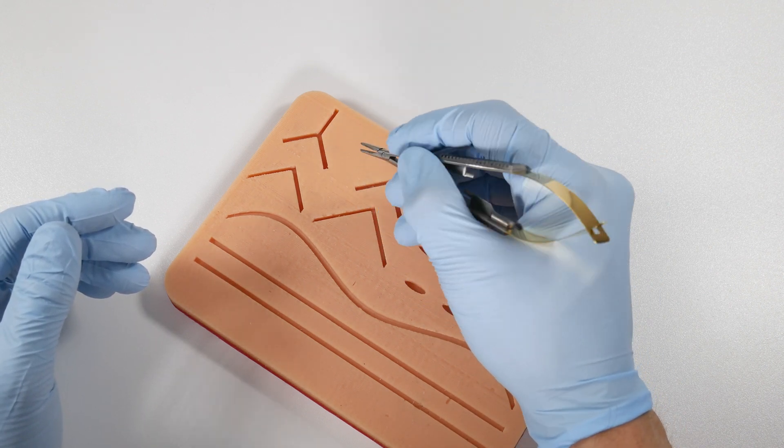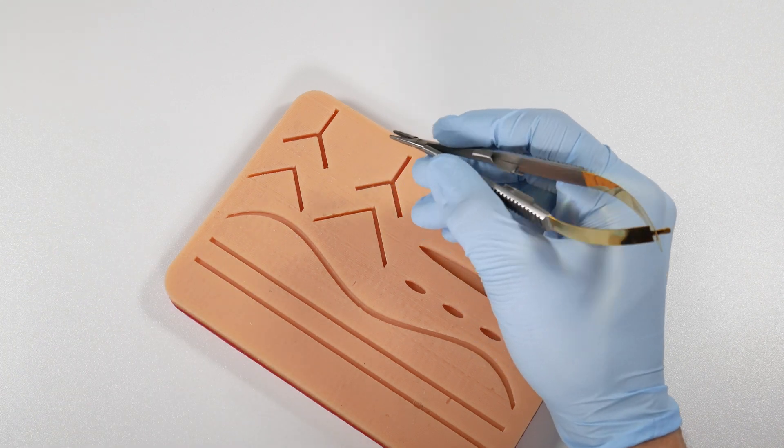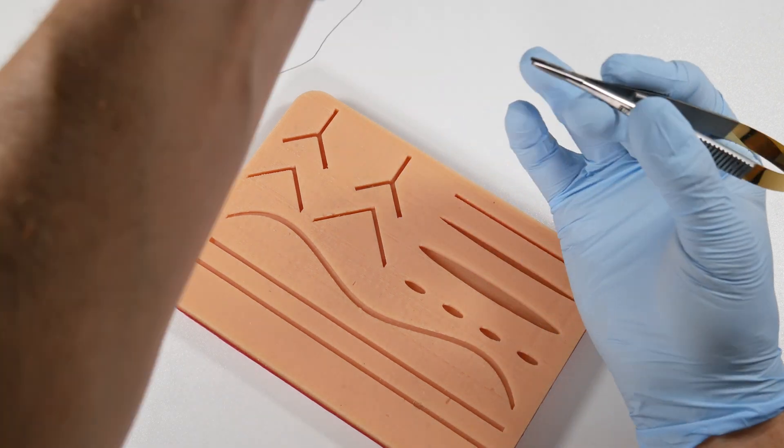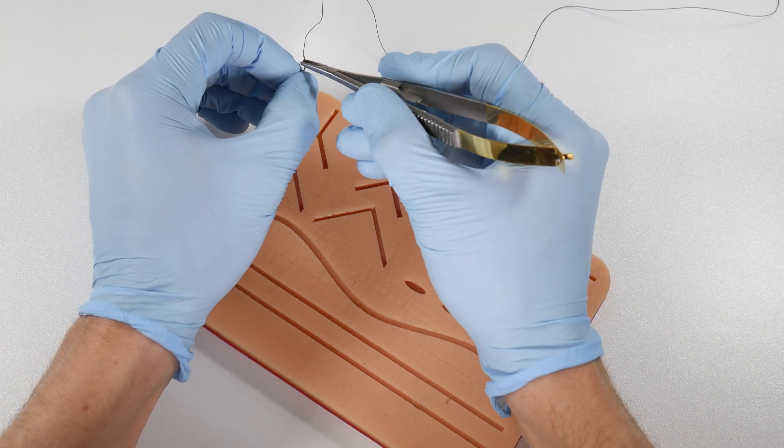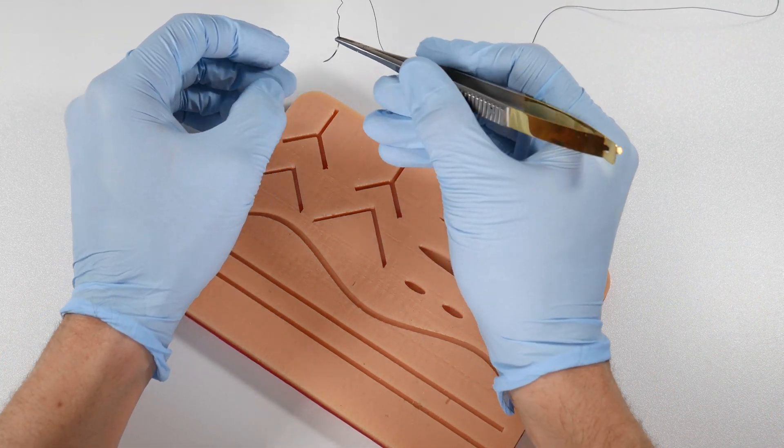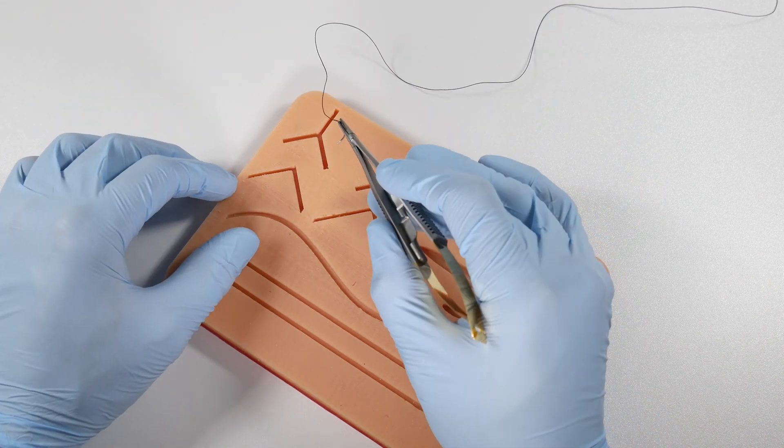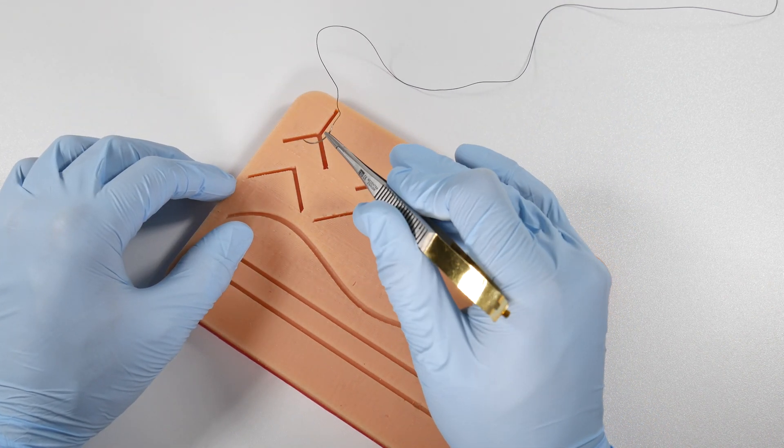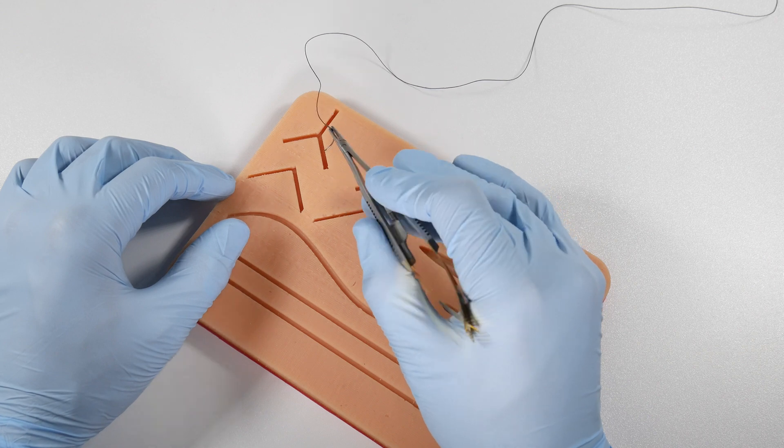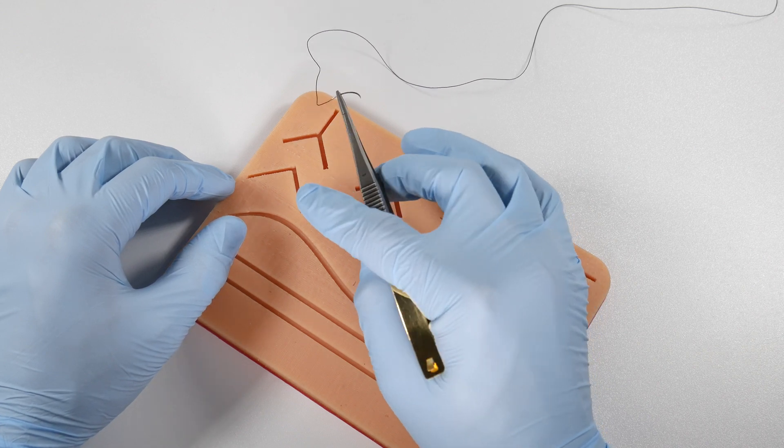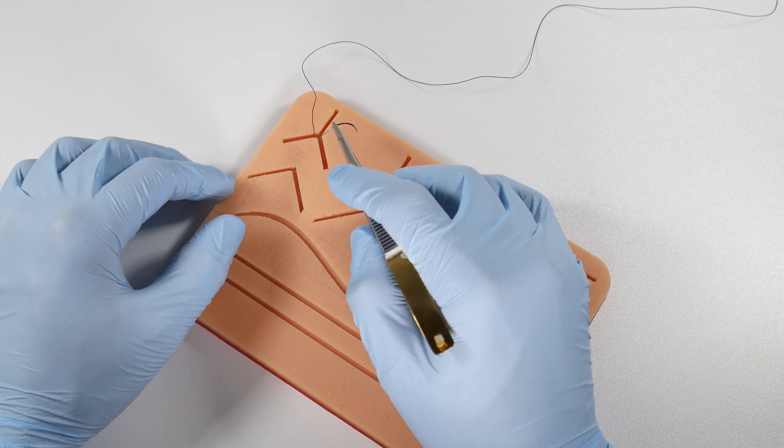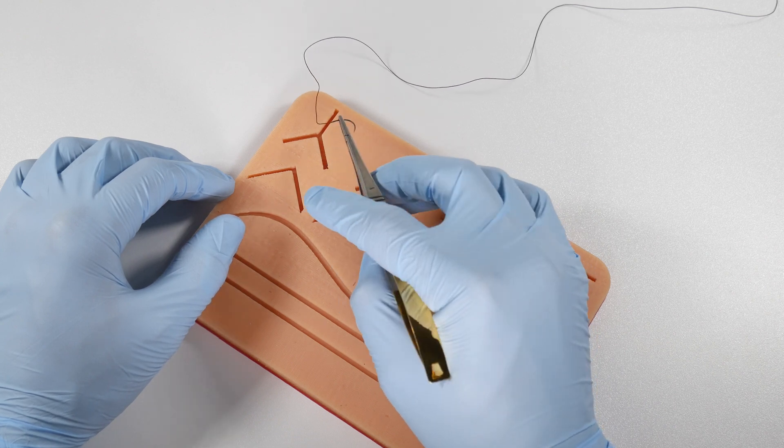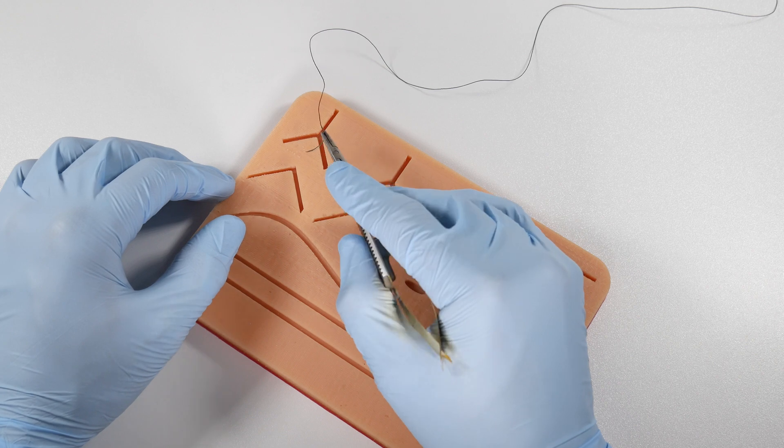If we look at passing a suture needle through the tissue, we'll grasp that just beneath that swaged end. One click locks it. Now you can enter the tissue. Look at the range of motion for a second—watch that needle. You can do like a full 180 degrees basically without really moving my wrist.